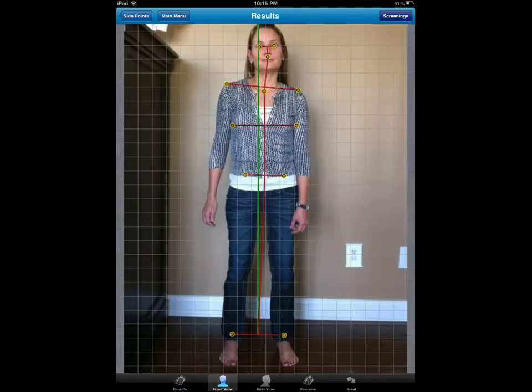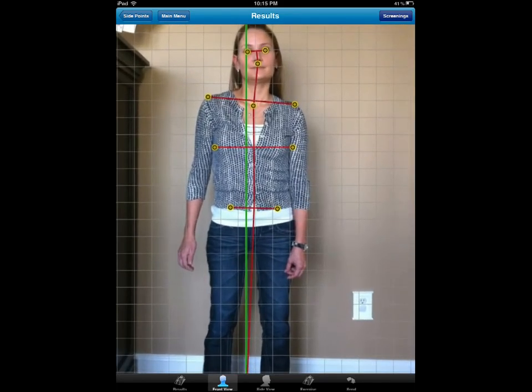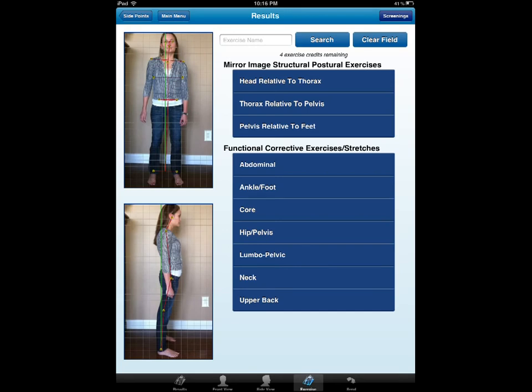Now we can go ahead and show the patient their posture — imagine this through wireless streaming to an Apple TV. But here's what's new and exciting: we have partnered with WebExercise to bring you over 150 exercises now available at your fingertips. At the very top, we have the mirror image structural postural exercises through Chiropractic Biophysics, as well as the functional exercises.